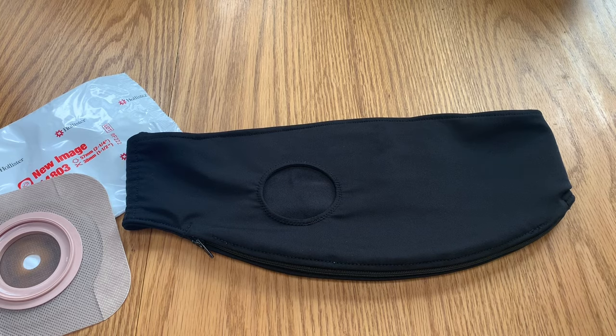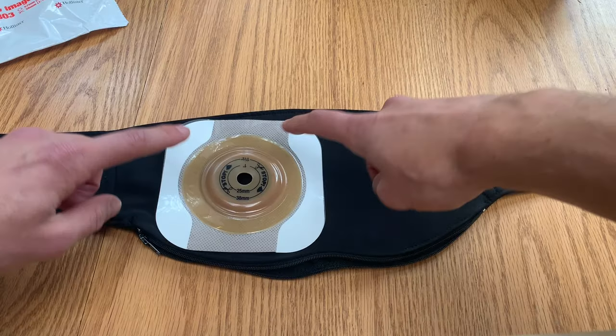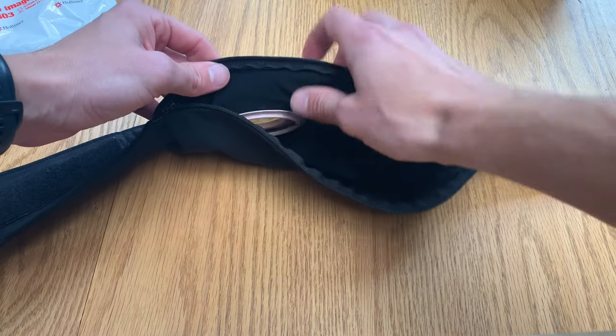Additionally, the Stealth Belt is designed so that the bottom layer is cut to the size of your flange. When you tighten it down, this bottom layer applies a gentle pressure to the adhesive around the flange, which helps the adhesive do its job a bit better. So it approaches the leak problem in two different ways.